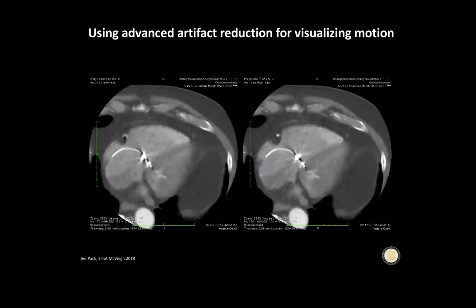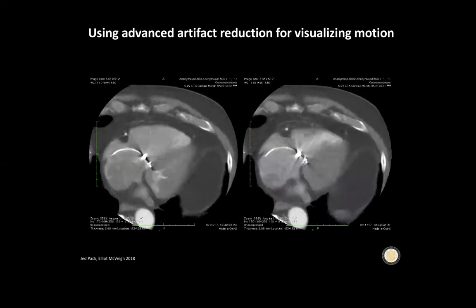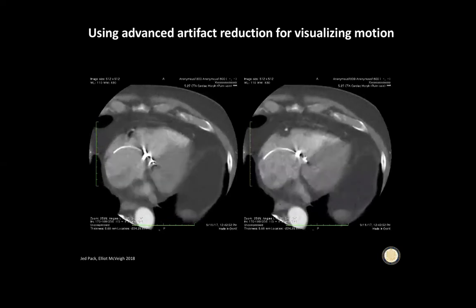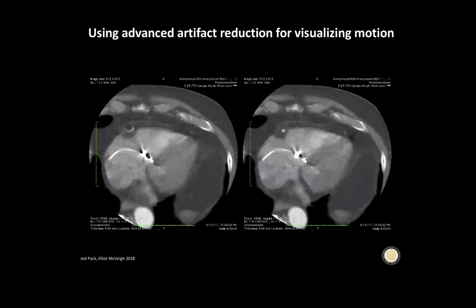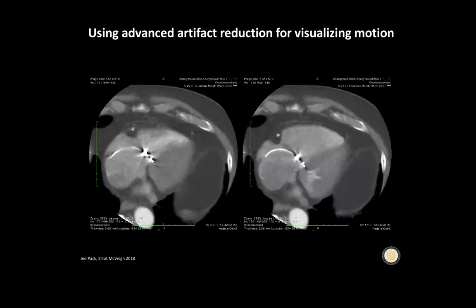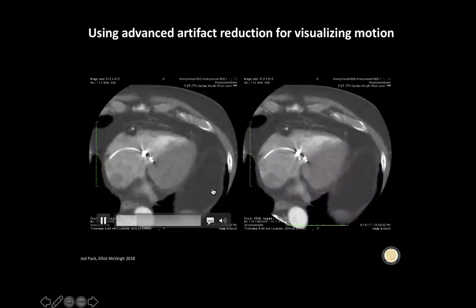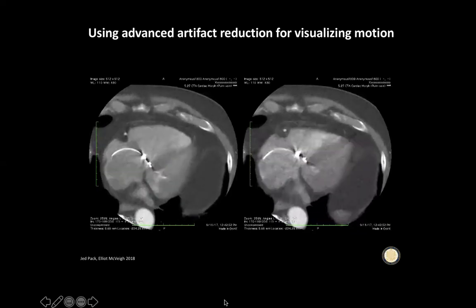And now it's incumbent on the person who's making that motion correction algorithm to then do some kind of phantom test to show that, in fact, the motion correction image is the true image. It's not just some other artifact image. Right? So, however, you can go a long way if you have a really good model.